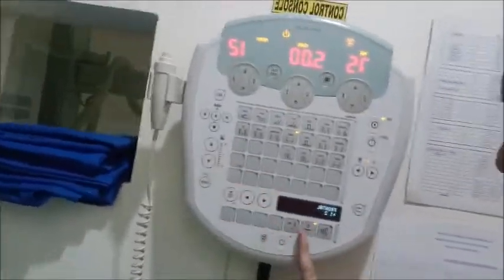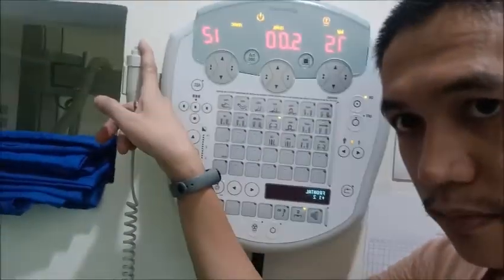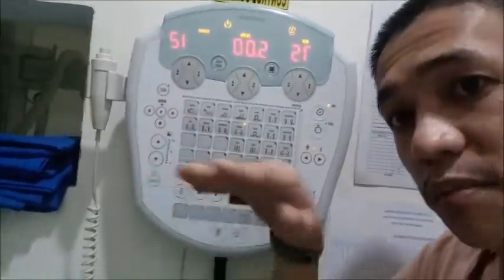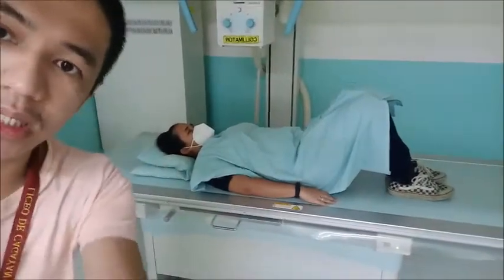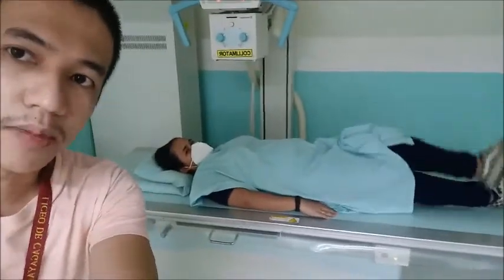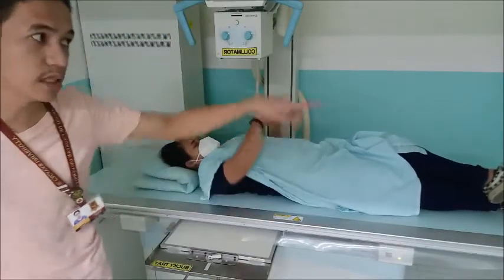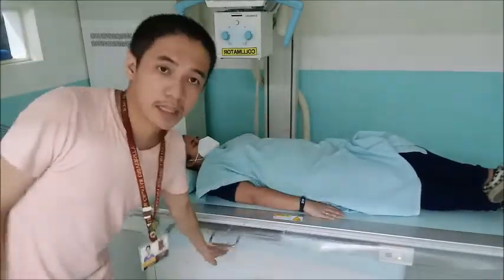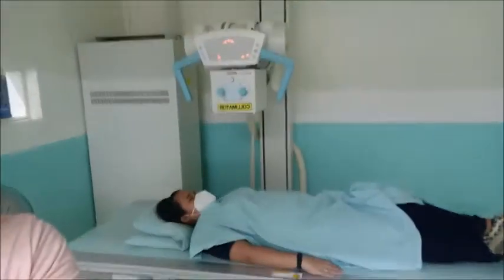So this time, if we activate it, that means if we expose now, then the table Bucky will move. Okay, again, the Bucky refers to the grid. The most common term in hospitals is Bucky, for example, Bucky tray, the chest Bucky. They usually have this terminology instead of using the word grid, but that's actually just the same.